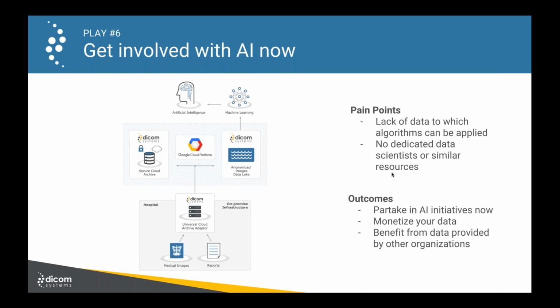And so think about all the dimensions of this. On the one side, you have a PACS that's being used every day in patient workflow. So you don't want to disrupt that by doing a massive DICOM query retrieve project on a Sectra PACS. Whether it's a Sectra or Fuji or whatever, DICOM query retrieve is going to tax the computing capabilities of that system and is going to slow down patient operations.